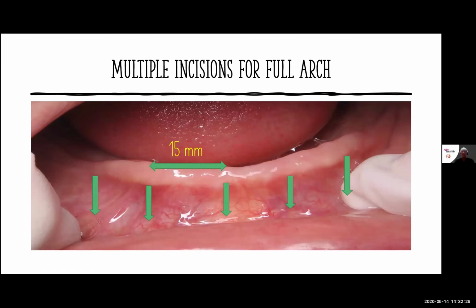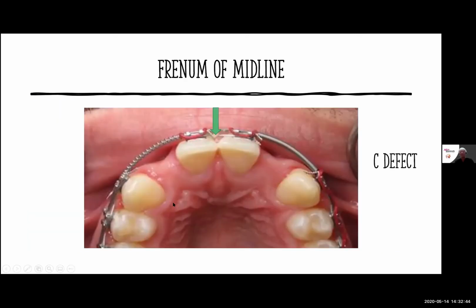The incisions themselves are similar, but the spacing of that is what we need to look at to make sure that we're going to be able to get access to the bone underneath. To get access to this bone right here, we need to have a window here and then another window here. And I'll show you more about what we need those windows for.